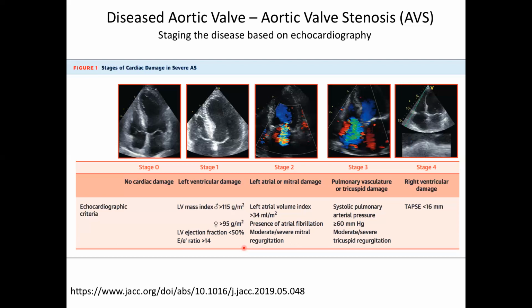So phantoms are good to understand whether or not your method is reasonable. It doesn't have some big problem, right? And then you optimize usually to get to the right answer. But the fact that you're tweaking your technique to get to that single instance of this physiological function usually doesn't generalize well. So you have to try it in people.